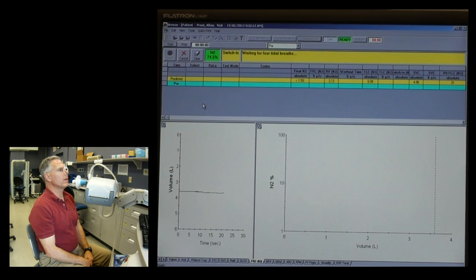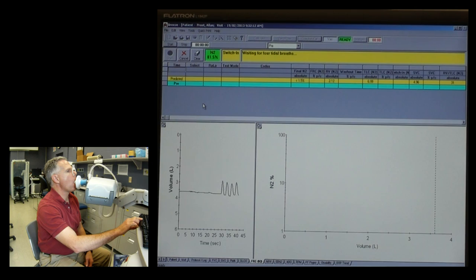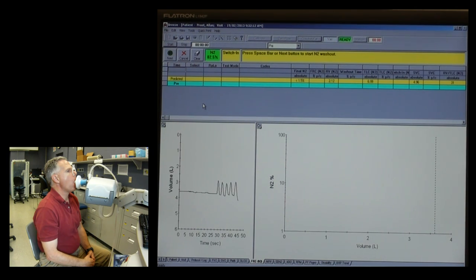Okay, so let's see how this works. Now, coach our patient to get on the device, make sure there's no obstructions to gas flow, get a good tight seal with their lips around the filter, make sure their nose clips are in place, and just nice, even, regular breathing to establish functional residual capacity. No change in their breathing patterns. Once we capture about 4 or 5 breaths, now we're going to click in, and you're going to hear they're going to be breathing that 100% oxygen with each breath.